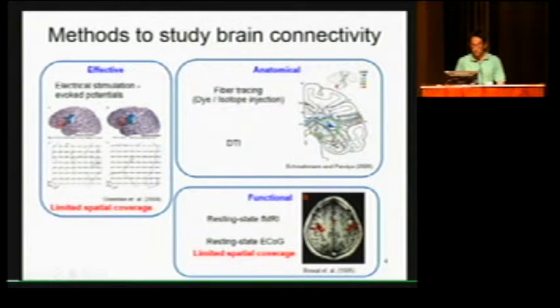And we are also doing this intracranial cortico-cortical evoked potential. So we put the grids here and grids here, and we stimulate one contact electrically and then record the evoked potential from other grid electrodes. We can sometimes clearly show the focal response in this grid. But this also lacks spatial coverage. So hopefully we want to know the whole-brain connectivity from one site.